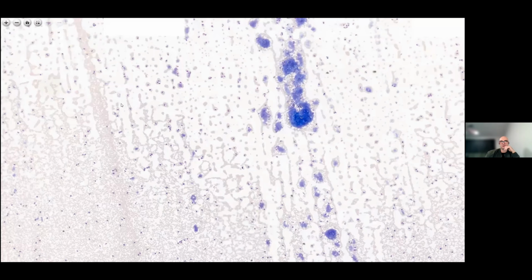But generally, like you said, Joe, for the clinical team, you want to find out why they've done it. Could there be a clinical reason that it's not mixed properly, or there was a traumatic venipuncture? And really getting another sample in a citrate or heparin bottle, using an alternative anticoagulant.